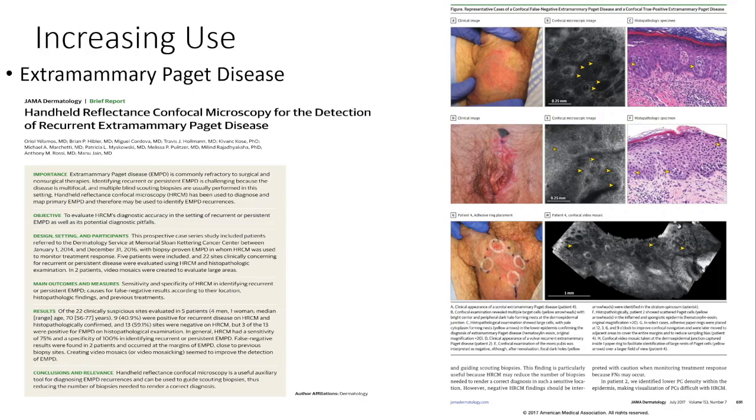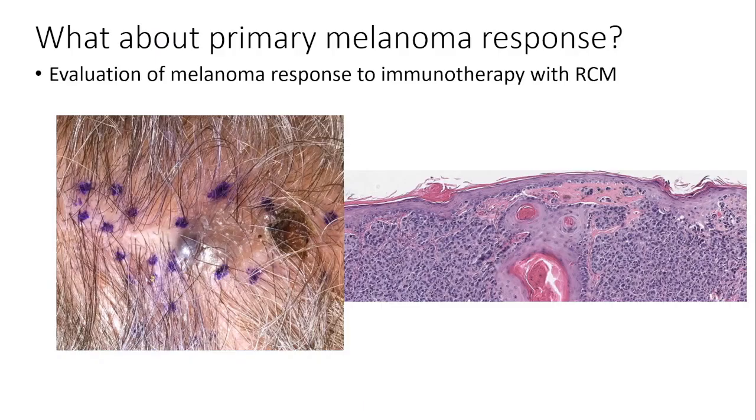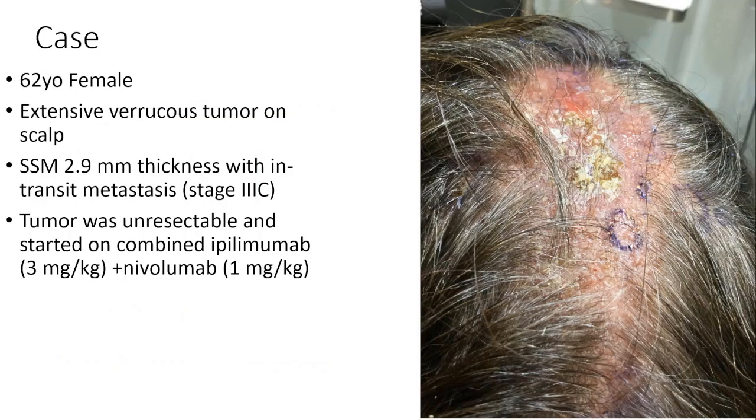And then even in really tough areas where we can get skin cancer, where people don't necessarily even want to biopsy, these non-invasive imaging tools are really helpful. So in the genital areas, and Dr. Tierney showed OCT of the cervical specimens, but even of the skin for really challenging extramammary Paget disease. And then we're utilizing it in novel ways in combination with new treatments that are non-surgical, such as immunotherapy, which has really changed the landscape of melanoma treatments or invasive melanoma treatments.